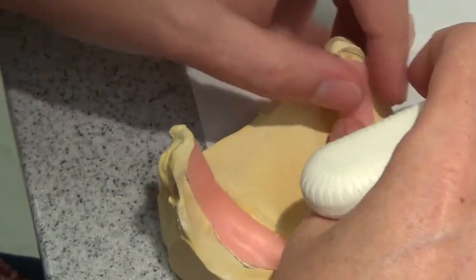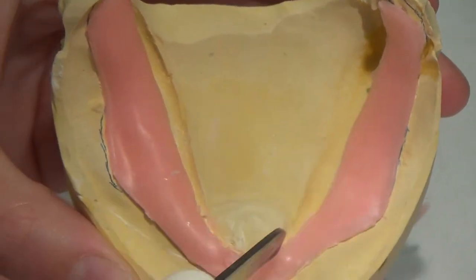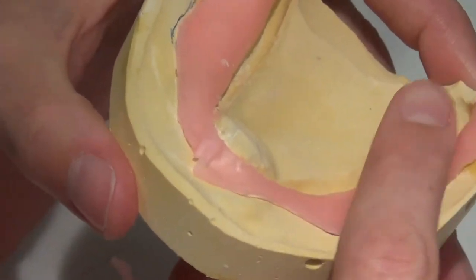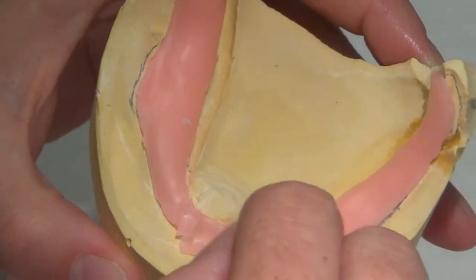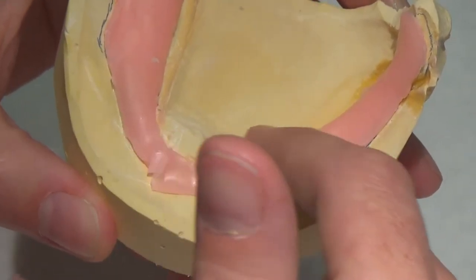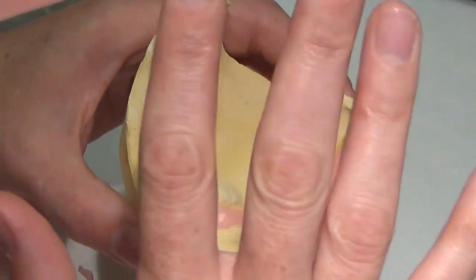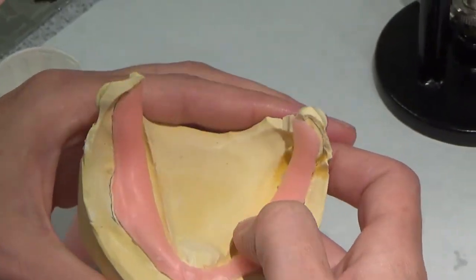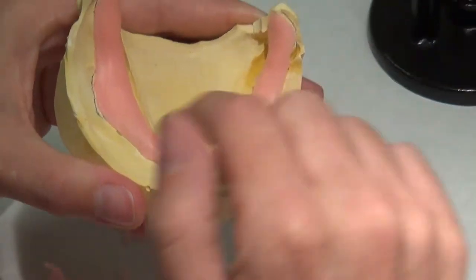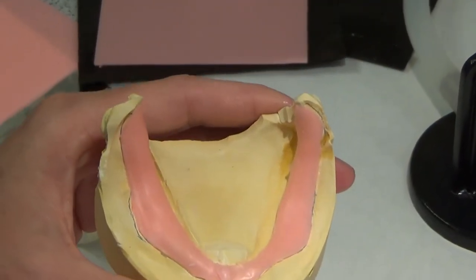Let me get this off and I'll demonstrate it. The mandibular nerve is running down along this line, the alveolar nerve right here through the mandibular canal. When patients have severe resorption like this, sometimes the bone can resorb so much that that canal can be exposed. When you touch this patient's ridge right here, it can actually hurt — you can excite that nerve. Because this denture is going to put a lot of pressure on this patient's severely resorbed ridge, I like to have a little extra block out in these scenarios so I don't compress too much when I make my impression.